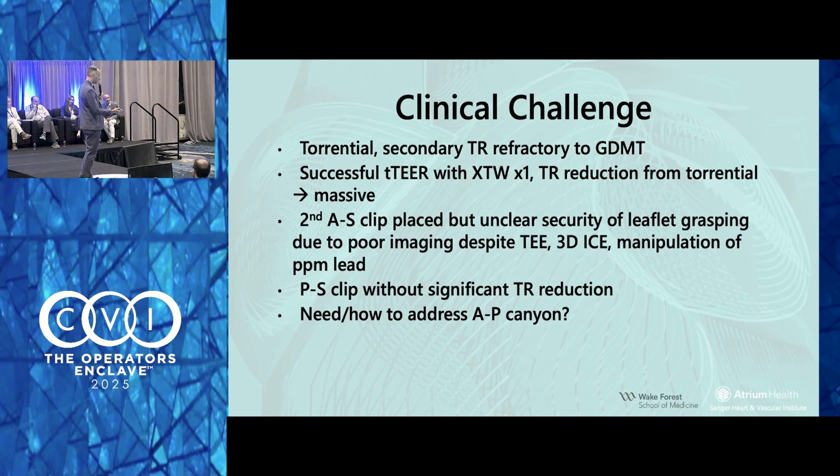We could move it, but moving it didn't help. Still had shadowing. When I use the Destino, it has a better ratchet than an Agilis, so it allows me to take my hands off a little bit more. But yep, we could move it, still had shadowing.